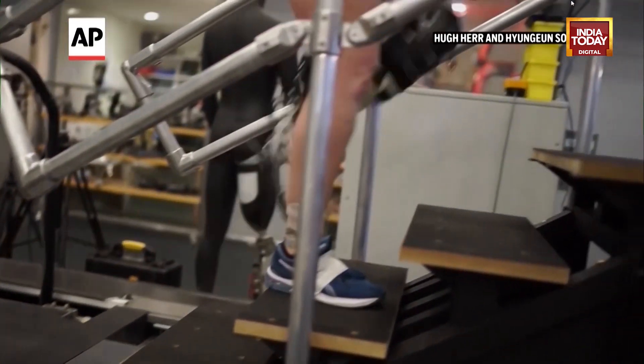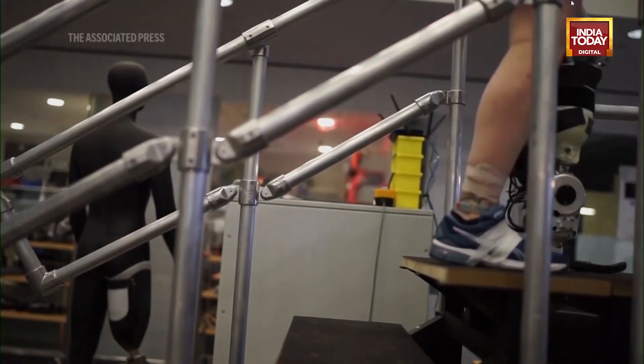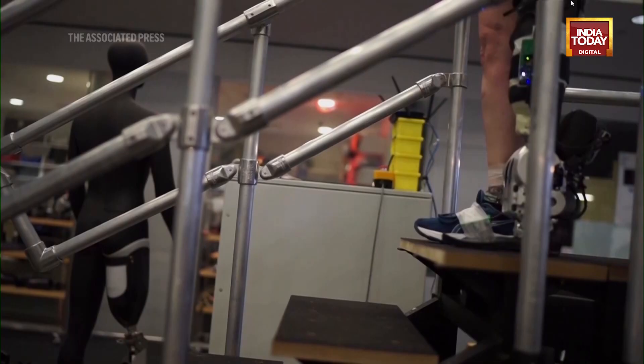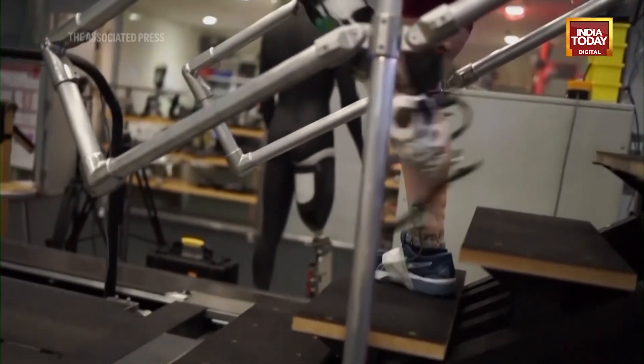When the limb is amputated, we connect muscles in natural agonist-antagonist pairs so that when the person thinks and moves their phantom leg, those muscles move dynamically just as they did before the leg was amputated. We then put sensors on those muscles to detect activations and movements.